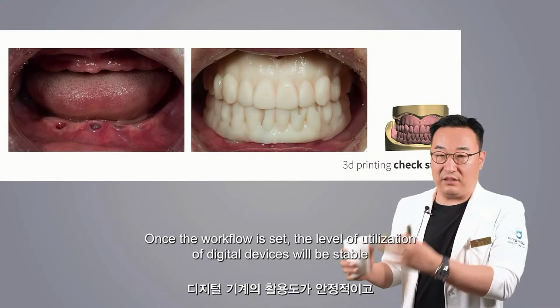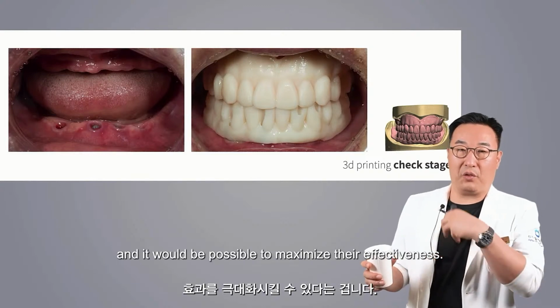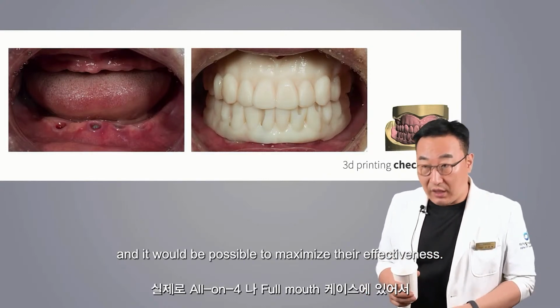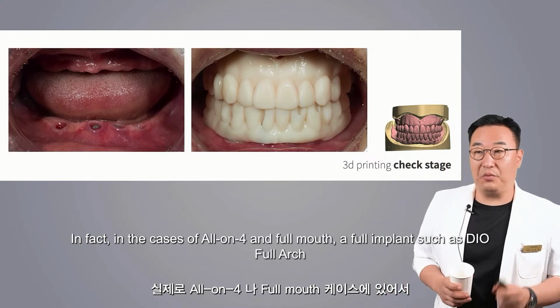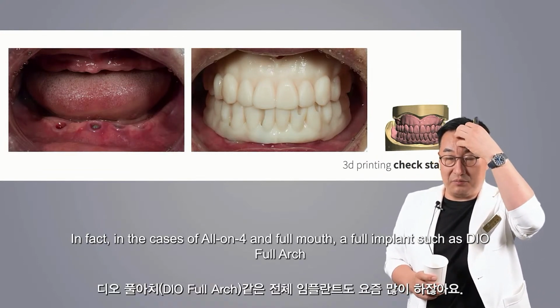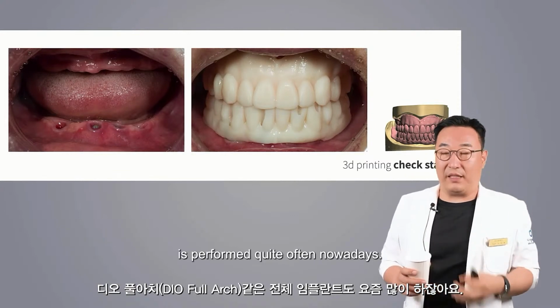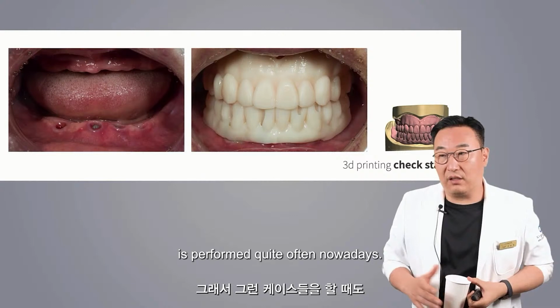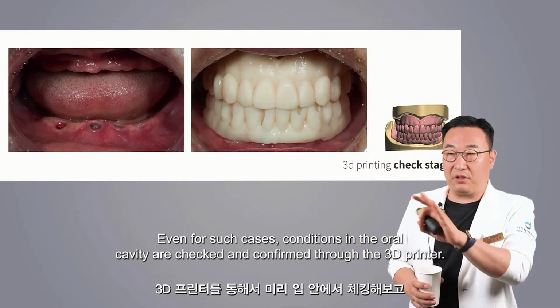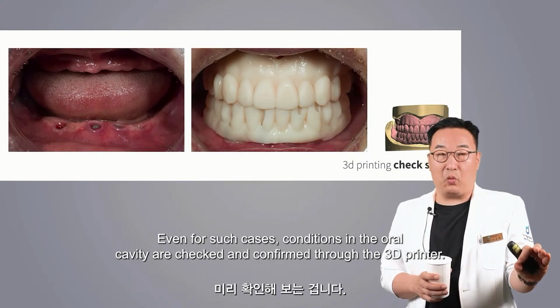Once the workflow is set, the level of utilization of digital devices will be stable, and it would be possible to maximize their effectiveness. In fact, in the cases of all-on-4 and full mouth, a full implant, such as DIO full arch, is performed quite often nowadays. Even for such cases, conditions in the oral cavity are checked and confirmed through the 3D printer.